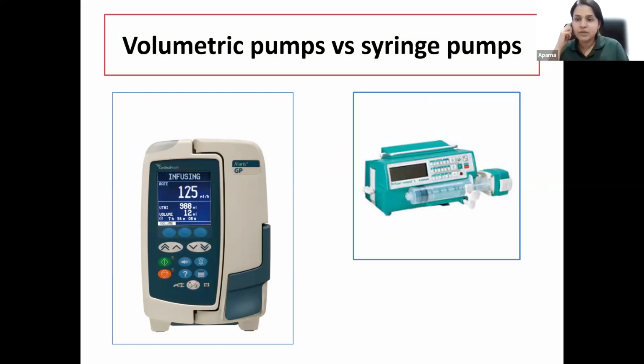There are different reasons why we see alarms in syringe pumps. You see a pre-occlusion as well as a proper occlusion alarm when there is any obstruction to the line going to the baby. We may also see an alarm because of the completion of the infusion, which is called the end of infusion alarm. Syringe pumps also alarm when there is a battery fluctuation, when they are running on battery, when they run out of battery, or if they have been disconnected from the power source. So these are some common alarms that we see in the syringe pumps.